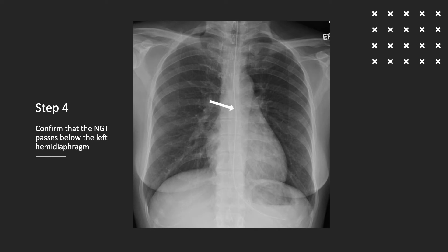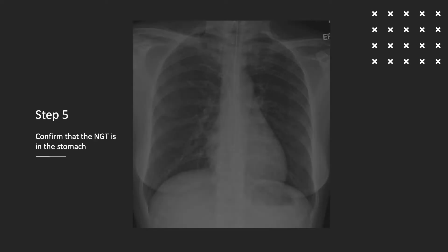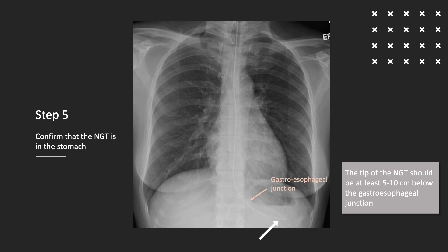The nasogastric tube should then be seen to follow the path of the lower esophagus and pass below the level of the left hemidiaphragm. The tip of the nasogastric tube should be clearly seen beyond the level of the gastroesophageal junction for it to be confirmed within the stomach.